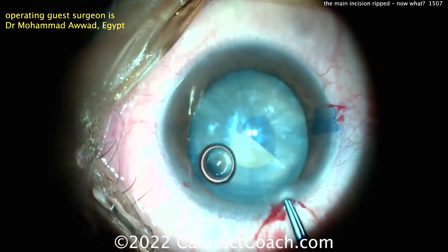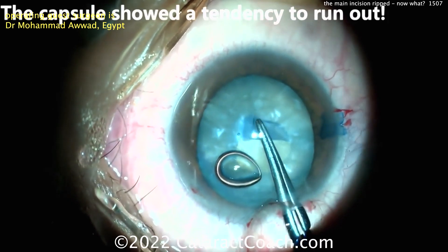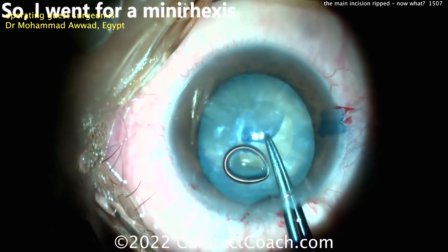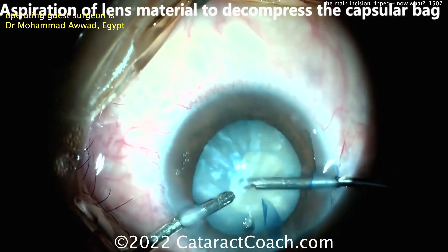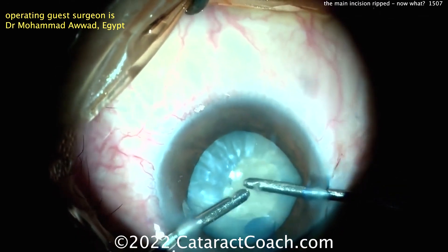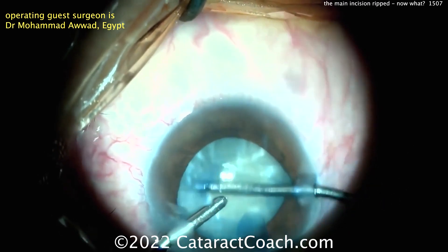A little more viscoelastic going inside the eye. Now with the forceps, look at that capsule — it has a tendency to want to run out on you. So doing a little maneuver there to bring it in. And now maybe a double rhexis technique here. Aspirate some lens material here, decompress the capsular bag. That looks good. Now we can continue to make the rhexis bigger now that you've taken the pressure out of the capsular bag.